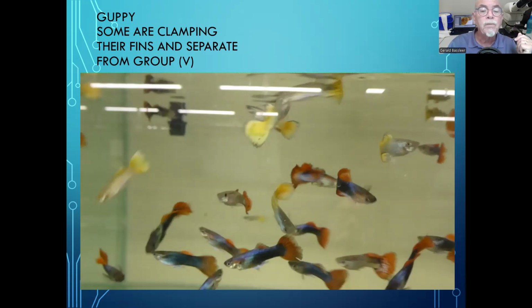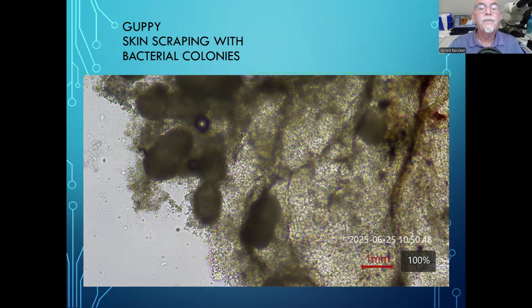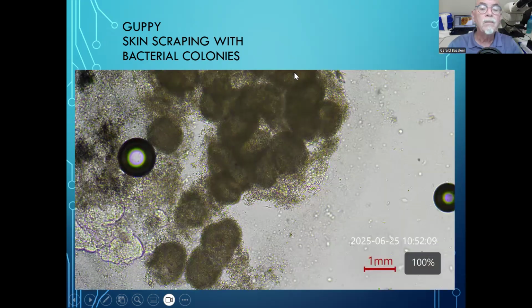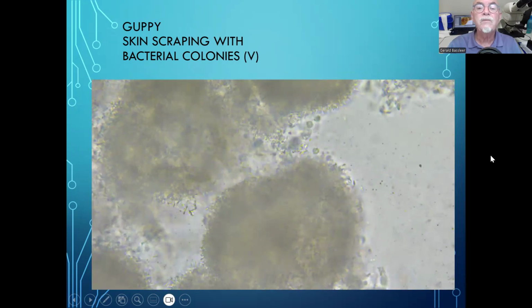and that's why I use a microscope. I took a scraping from the skin, and that revealed a massive amount of bacteria loaded on the scales. All those dark patches are colonies of bacteria. Here we see it in more detail. Big groups of bacteria clustered together, and here more, all colonies of bacteria, and you can see even they are moving.